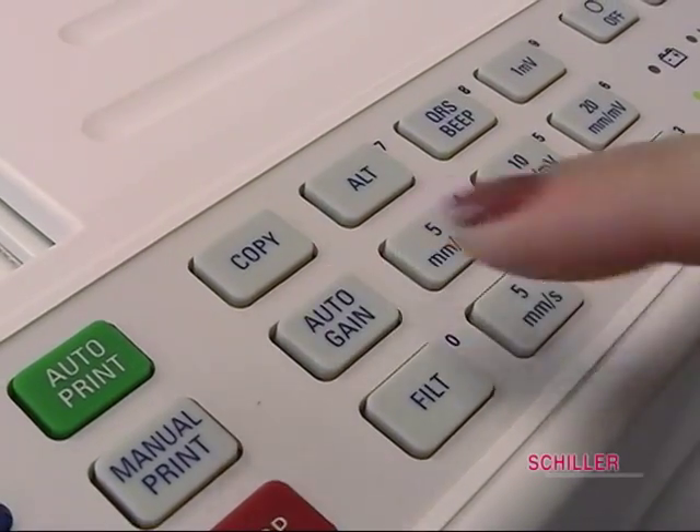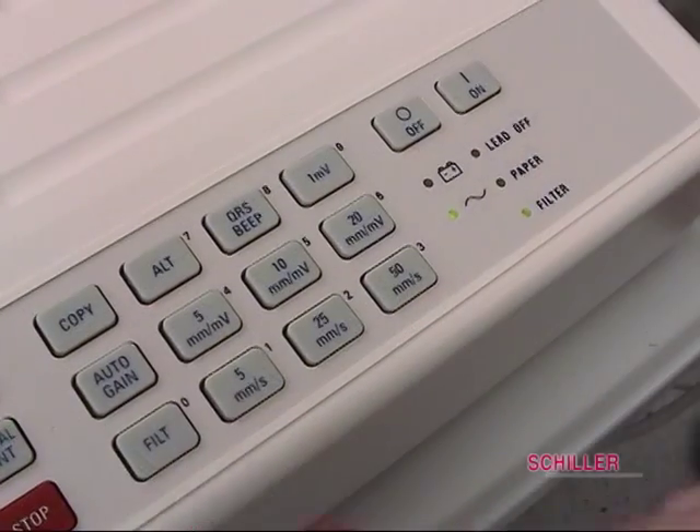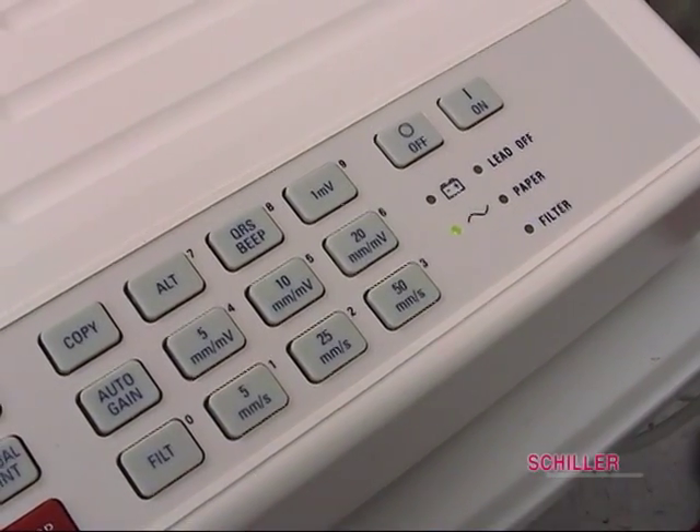Auto gain is for sensitivity. In auto ECG mode, this is automatically set to the best setting and strength of signal. Filter turns the myogram filter on and off.